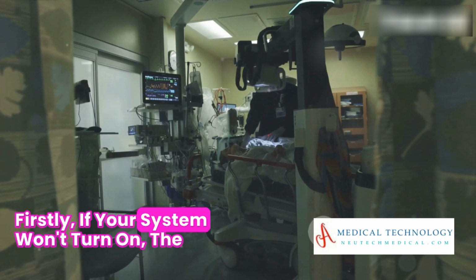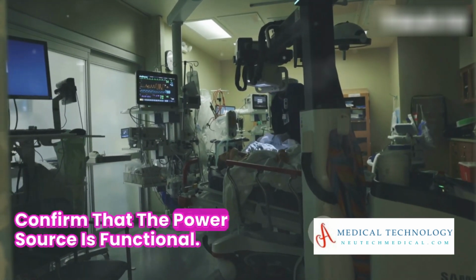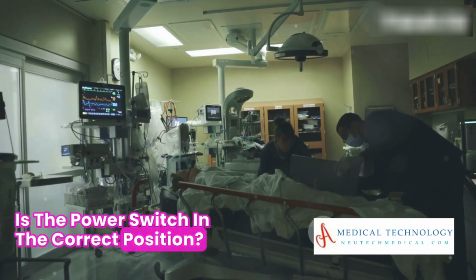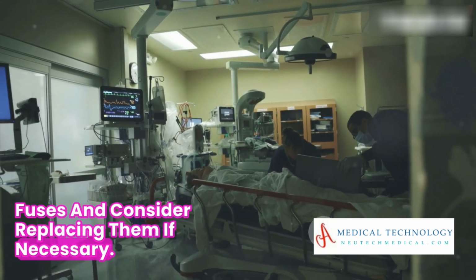Firstly, if your system won't turn on, the initial step is to check power connections and confirm that the power source is functional. Is the power switch in the correct position? If yes, it's time to inspect the fuses and consider replacing them if necessary.